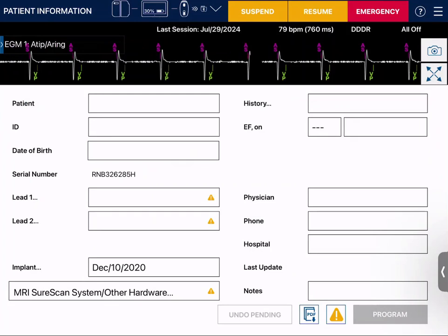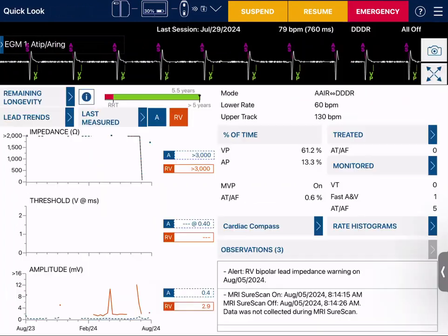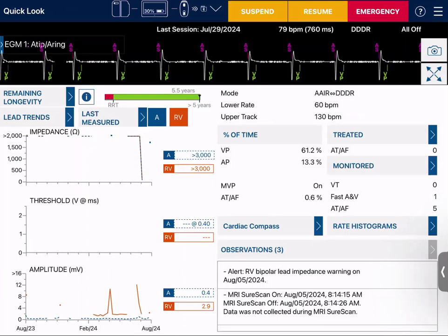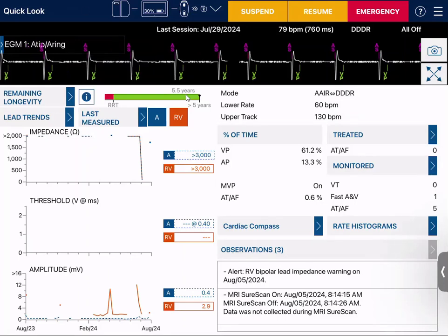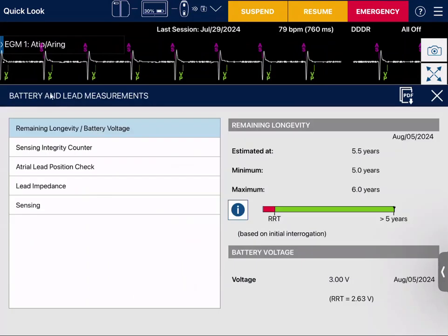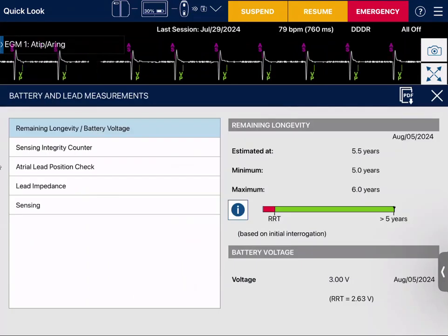We'll go back to our quick look screen and see what our battery shows. Our battery is 5.5 years. If I click where it says remaining longevity, it will give me the minimum and maximum for what the battery life is.